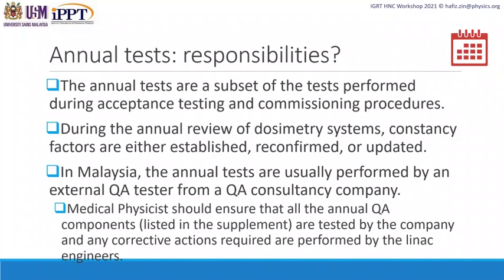But in Malaysia, because we follow the requirement to have the test performed by an external QA tester, which is licensed, usually from a QA consultant company, the in-house medical physicist does not perform this annual test.